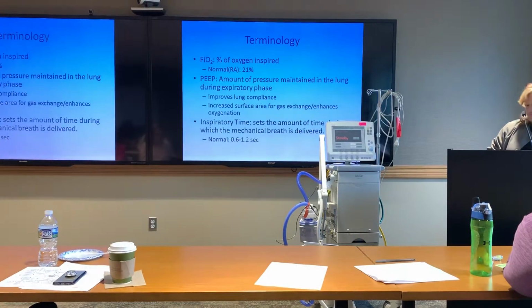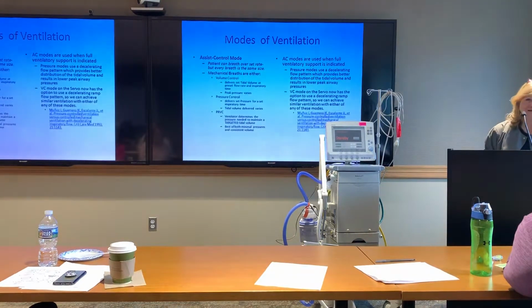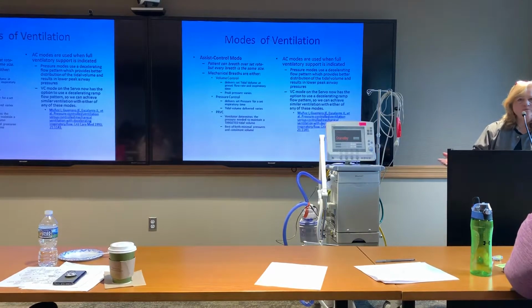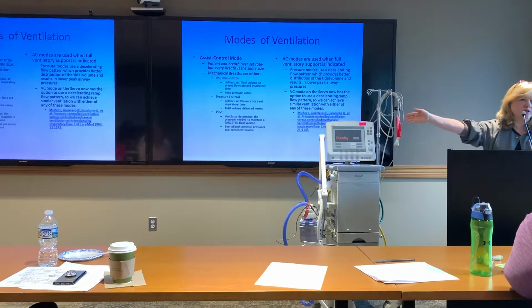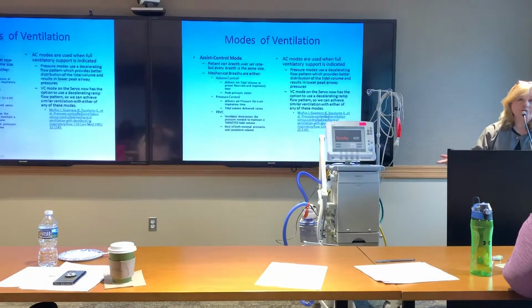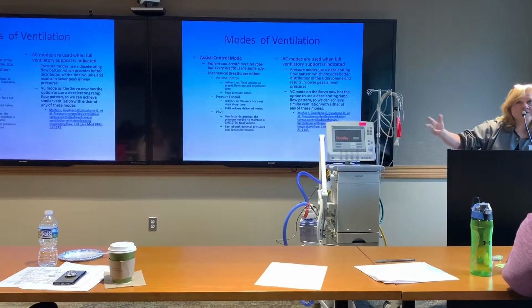But anyway. All right, so modes of ventilation. You'll hear all kinds of descriptions. I like to keep it really simple. All right, assist control. There is a control mode, but nobody uses it anymore. There's no ventilator out there that will allow you to lock the patient out, which is what a control mode would do. I'd actually turn it off and not let the patient trigger the machine. We don't do that anymore. So ignore anything you read about control ventilation. Assist control, you're going to have a set rate and a set other value, whether it's a set tidal volume when I'm in volume control, or a set pressure level if I'm in pressure control, or a set volume limit if I'm in PRVC.